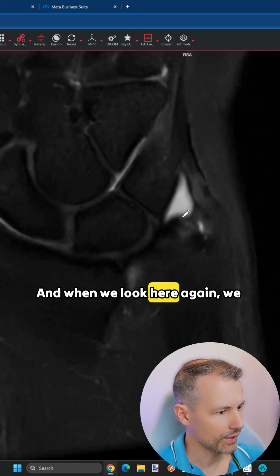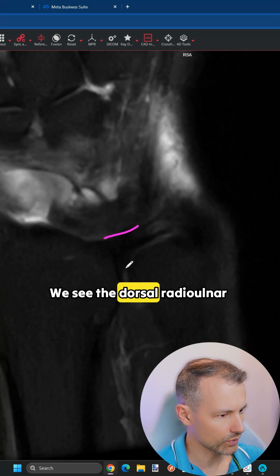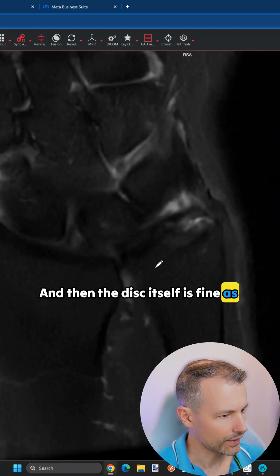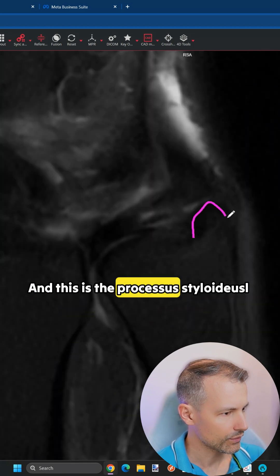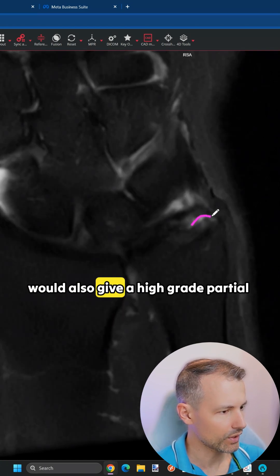Looking here again, we can confirm the disc is intact. We see the dorsal radioulnar ligament intact here, the volar radioulnar ligament intact here, and the disc itself is fine as well. The area where we see a little bit of fluid is here, and we know there is no contrast in there. This is the processus styloideus ulnae, and because we have fluid here in a location where we wouldn't expect it, I would consider a high-grade partial tear.